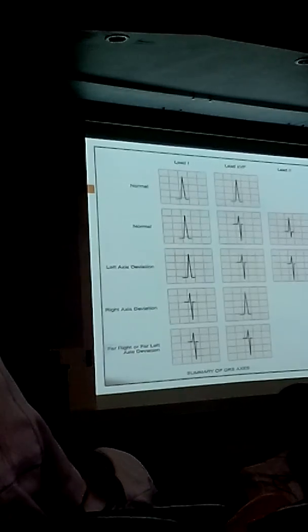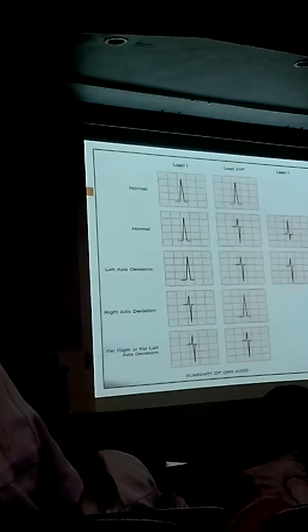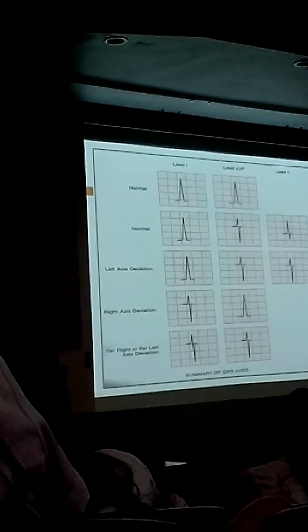So remove both the positive and the negative deflection.